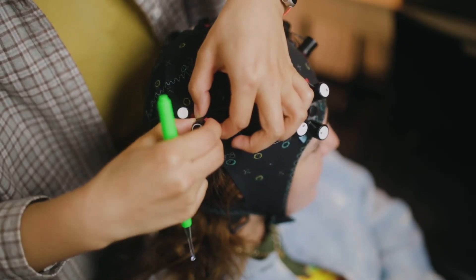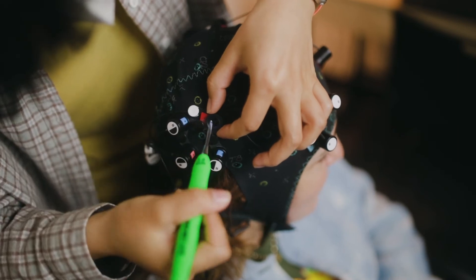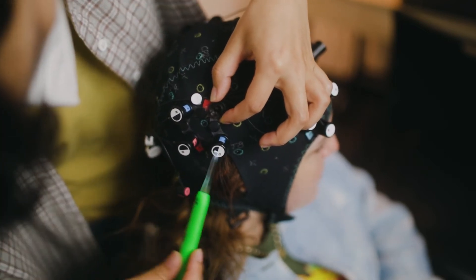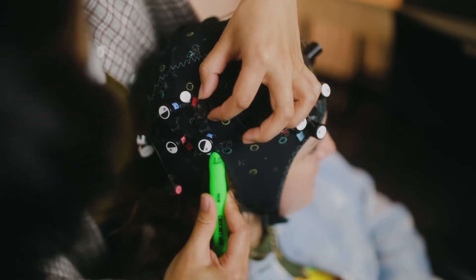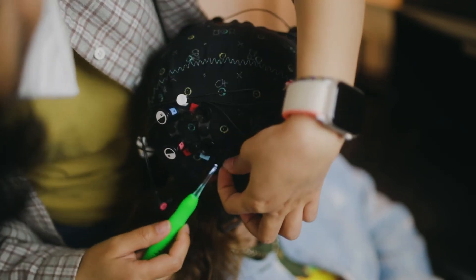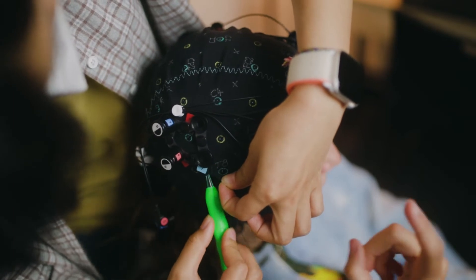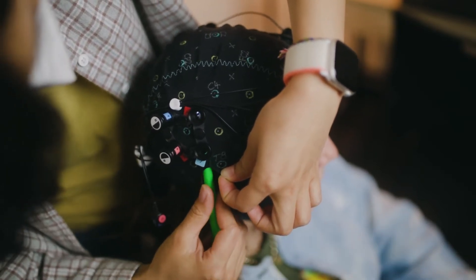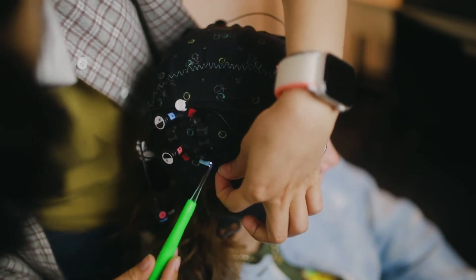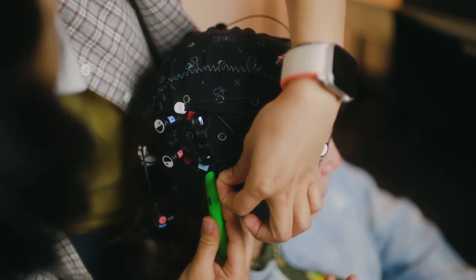Now we're going to show an example of if you accidentally hook some of the hair and pull it out of the cap, and how to fix that issue — because it can happen on accident. What Ying is about to do is get the hair back in so it doesn't tangle or block the optode from making contact with the scalp. She uses the hook side of the crochet hook, goes under the cap, finds the hair that is pulled out, hooks it back into place, and smooths it out so it doesn't affect the signal of any other optodes.